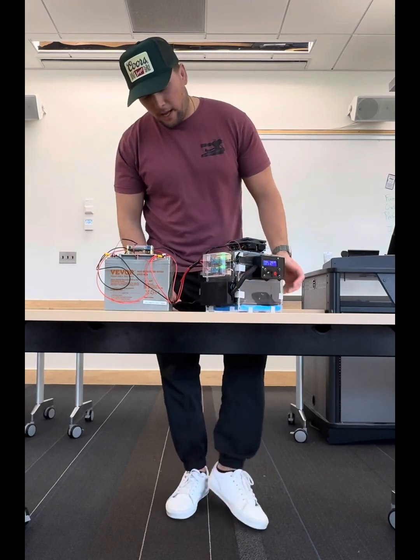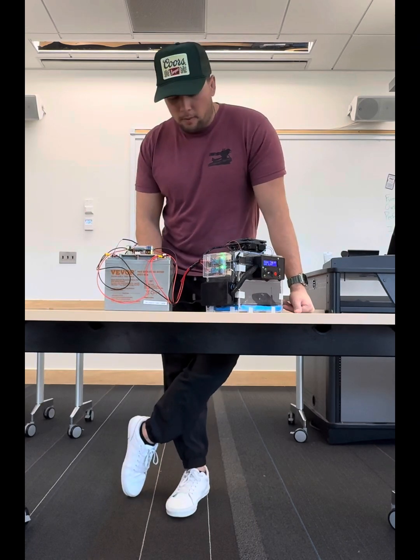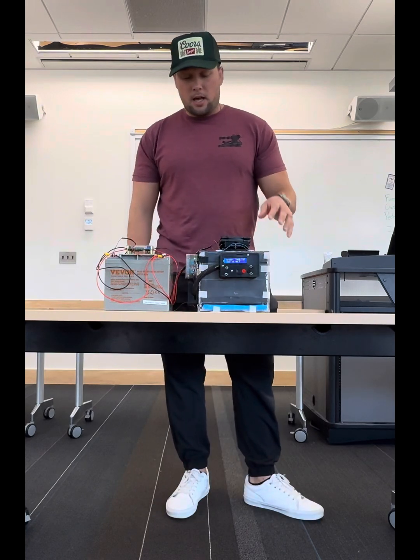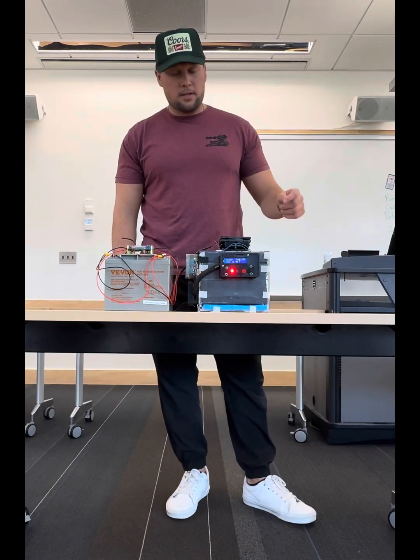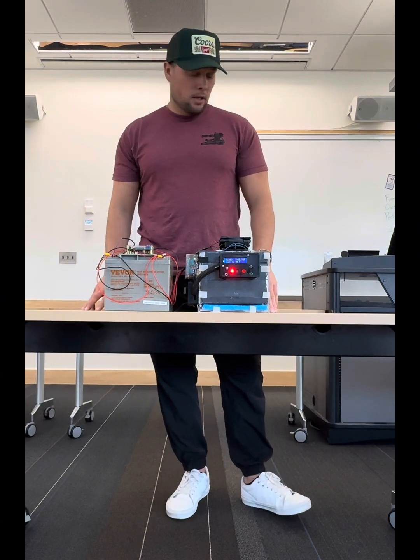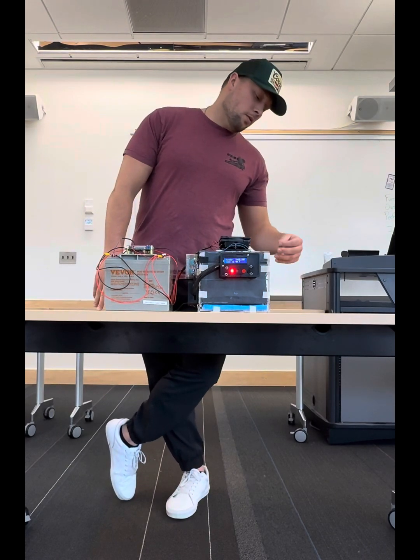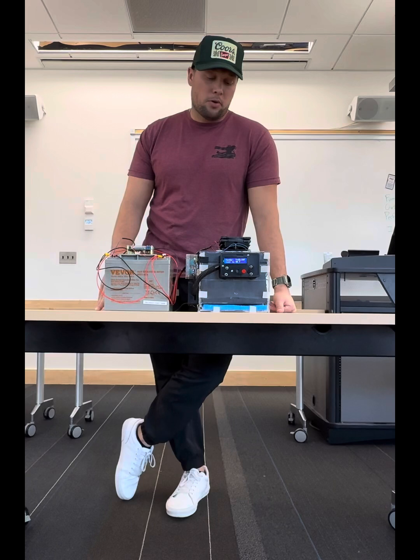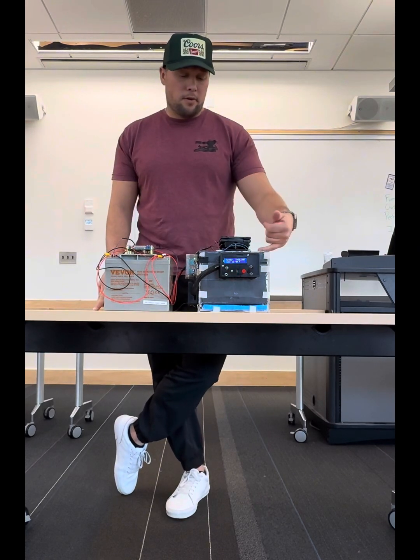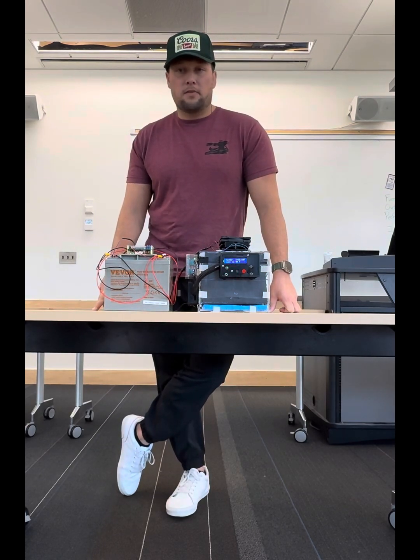On the side here, we're going to have our relay box on the top, and then on the bottom we're going to have our Arduino box. Each of these is going to be a structure and a case to hold all the circuitry. On top you can see the Peltier assembly. On top is going to be the cooler, and inside the actual cooler itself, under the lid, we're going to have the Peltier. On the inside is going to be a foam structure. Styrofoam itself is all cut to specification as outlined in the final report as well, based on the SolidWorks drawings. The fan is mounted by these 4 pucks on top of the lid, and then inside we're going to have a 3D printed 5-hole vaccine vial holder.